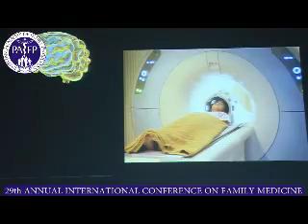The same holds true for the metalwork placed in the spine, the hips or the skeleton. We all feel that it probably is not worth our while to place these patients into MRI because, one, they give a lot of artifacts, and secondly, we don't know how it will behave. What happens to these metal components inside your body?